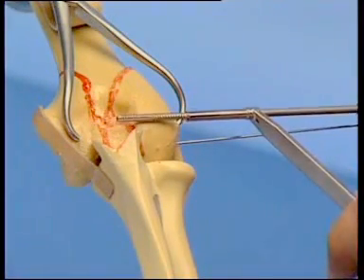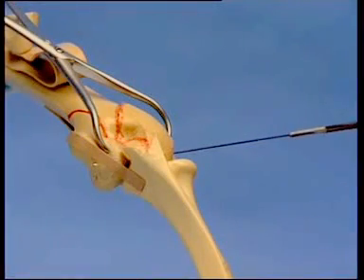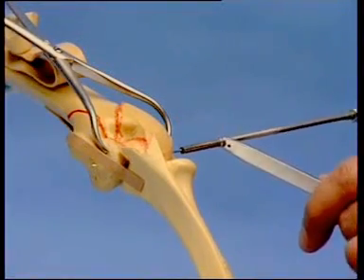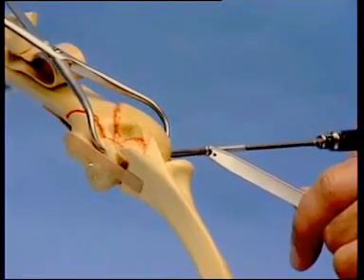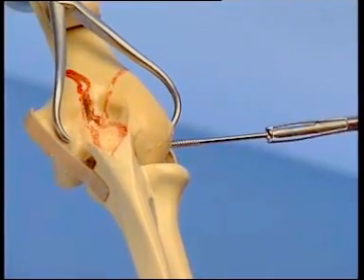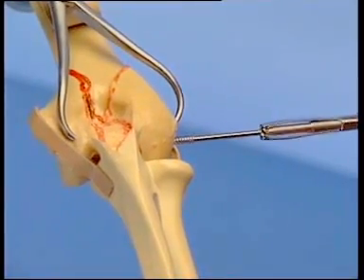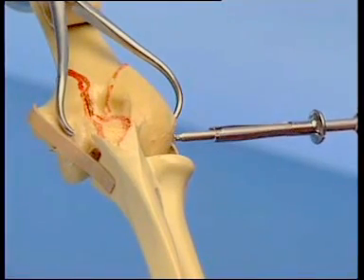The cannulated tap is used only to give the screw a good start in hard cancellous bone. Insertion of the 3.5 mm cancellous screw follows. Tightening the screw induces interfragmentary compression, securing the articular fragments to make them one block.